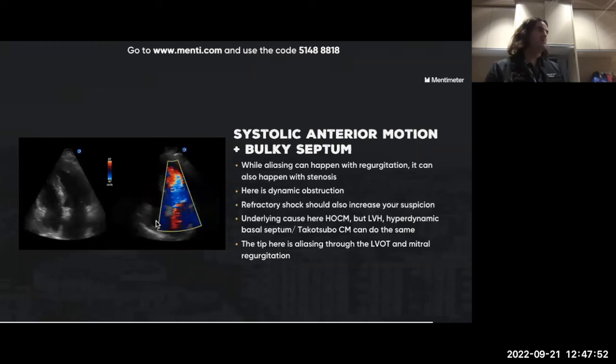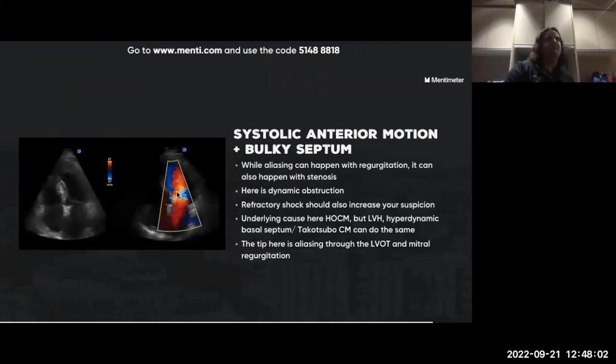So eccentric MR is very, very common with systolic anterior motion. Once you see this and you see that, you can almost say, it's SAM. Just that combination of flow acceleration and eccentric MR should be your first suspicion, because SAM truly can be a visual diagnosis. You see that when this valve shuts, it's all the way over there. That's pretty obvious. So that's to cue you in about those signals. Flow accelerating there is most likely systolic anterior motion.